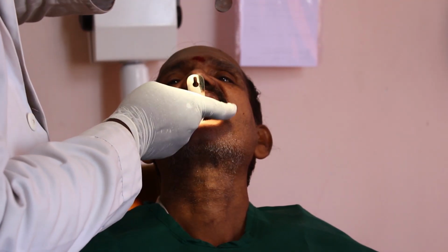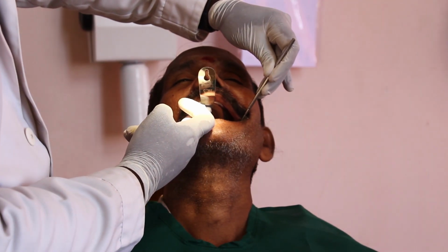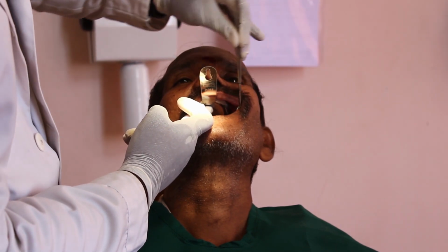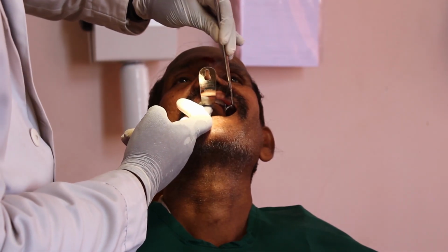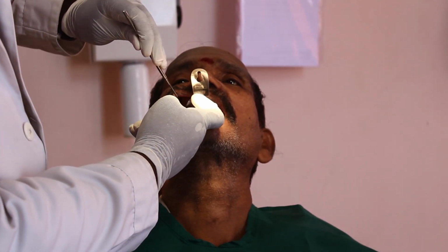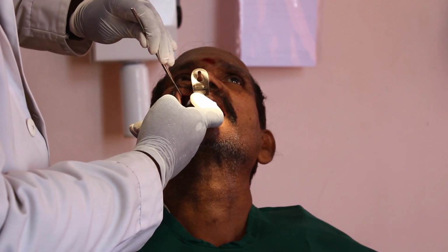After seating, you have to verify whether the posterior extension is covered properly, covering the pterygomaxillary notch and also the vibrating line, that is the posterior vibrating line. And then you have to see whether the sulcus is being covered, the buccal sulcus and the labial sulcus, and also the frenum. And make sure that there should be about 3 to 5 mm of gap between the tray and the alveolar ridge. That's a space for the impression material to flow and record.